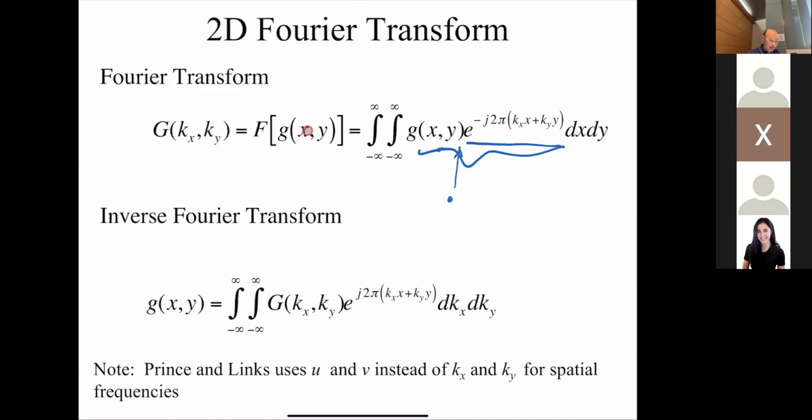So the next step we want to talk about is how do we do this integration? Let's work up to how we do that. The gradients do the multiplication for us by getting the spin patterns. And then the next question is, let's look at that in a little more detail, and then we're looking at the integration next.